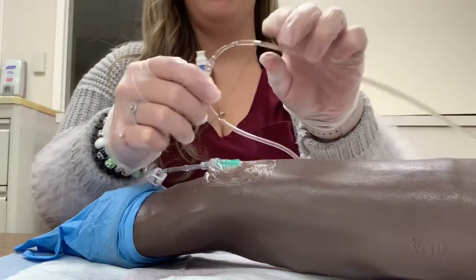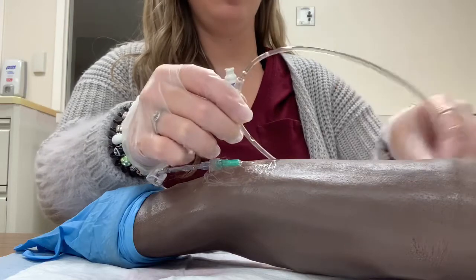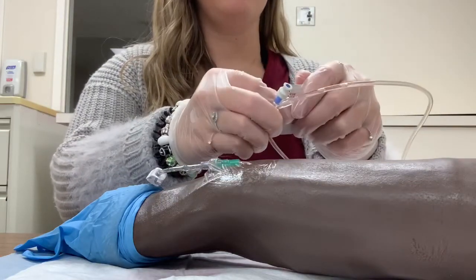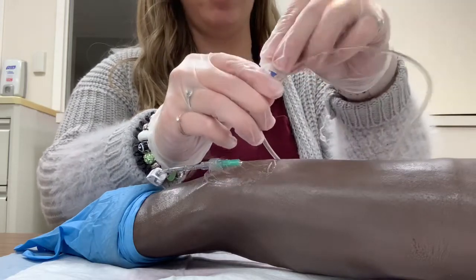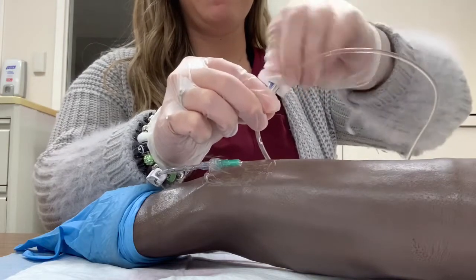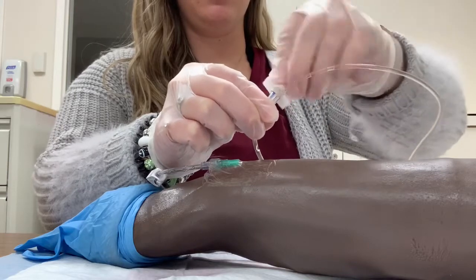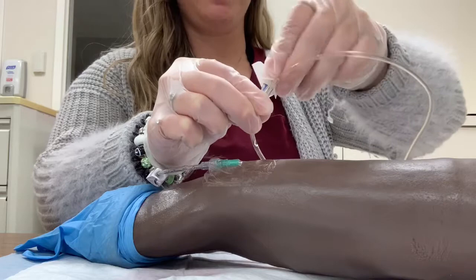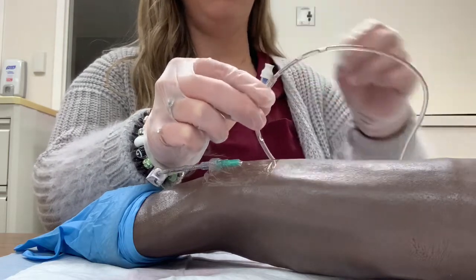I would find the port closest to the IV site. I will take my alcohol swab and alcohol it off for 15 seconds, and then I will let that dry.